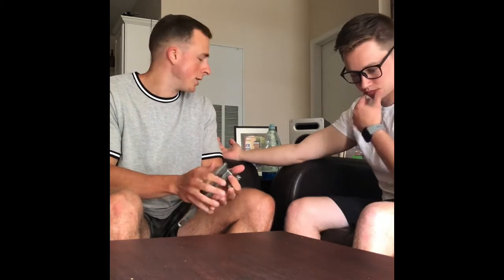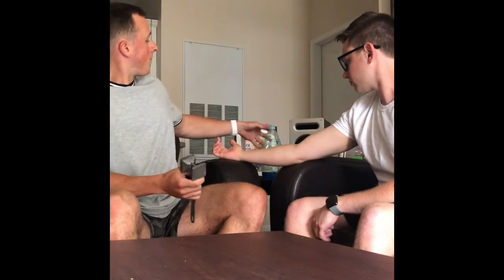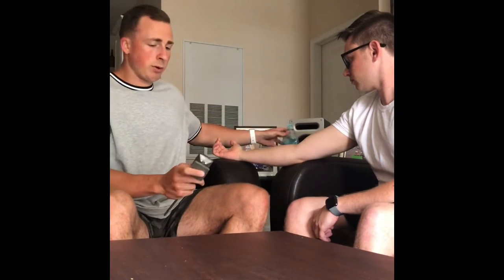So what we would do first is we would put the medications on the medial side of the elbow here, and then after we put the medications on, we would put on the ultrasound gel in the area, and then we would just continuously move the ultrasound head in order to prevent any thermal effects. There should be no thermal effects, but moving the ultrasound head will prevent any of that from happening. And then we'll just work the medications into the medial side of the elbow here.